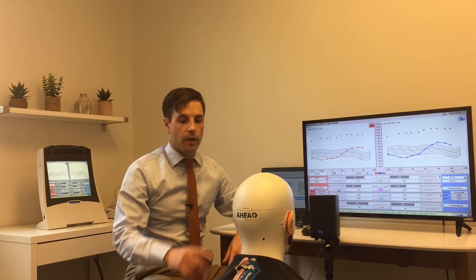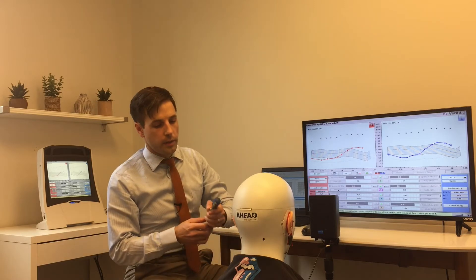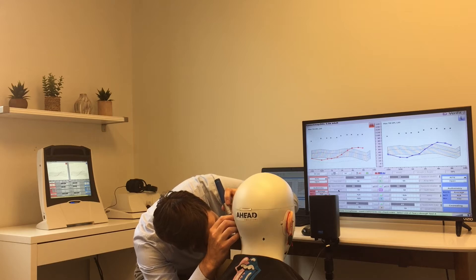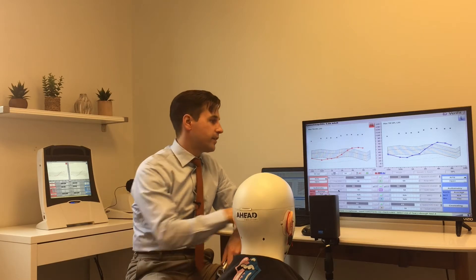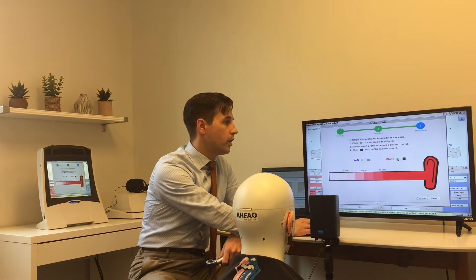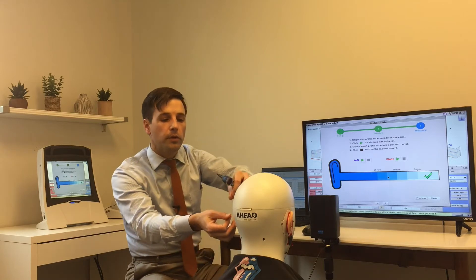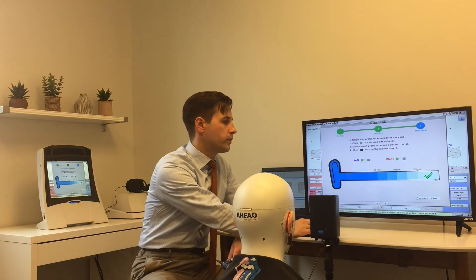I've got Carl rigged up with the probe modules and I've inserted the probe tubes into his ears. I'm just going to take a quick look in his ear to make sure I've got it parked right on the ridge that goes down to the tympanic membrane. That's looking good, but there is a way I can check it — the Verifit 2 has the probe guide and you can run a quick run to see that you've got it in the right place. I always like to put it in the way I've always done it, get it in the right spot, and just make sure everything looks good.